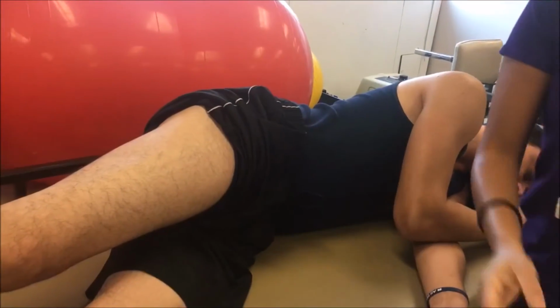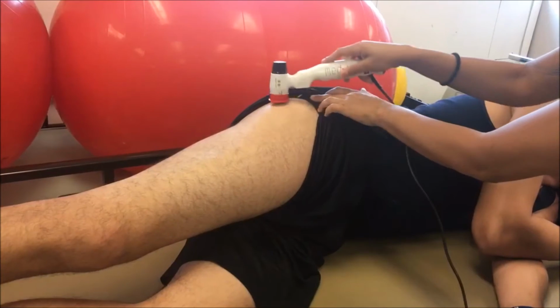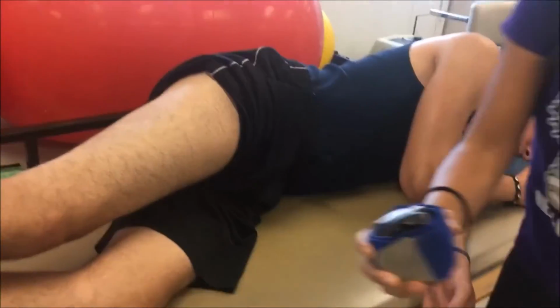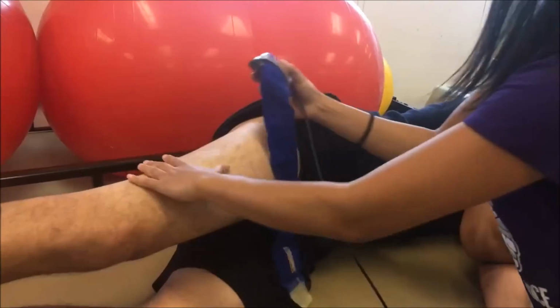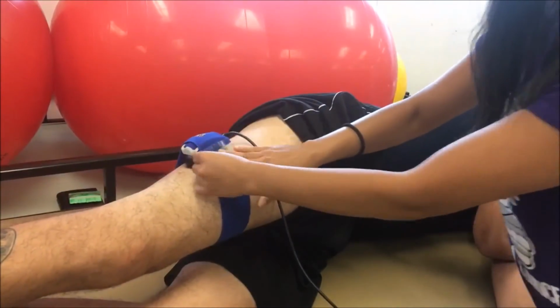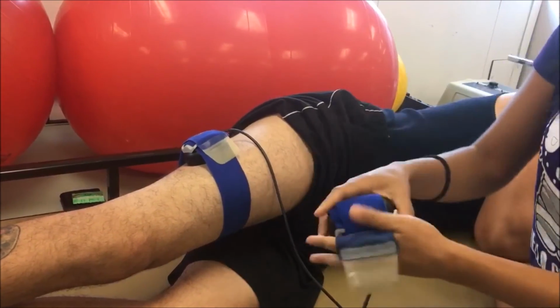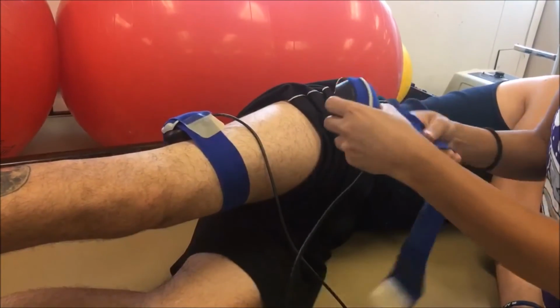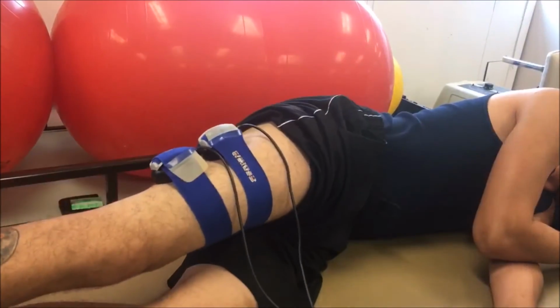For trochanteric bursitis, we will place the laser on the greater trochanter and then around the area of the greater trochanter. And at the same time, we could place the SLD on the tensor fasciae. Thank you. It's a very helpful patient. We'll place another one. Place another one. And then the laser, the greater.